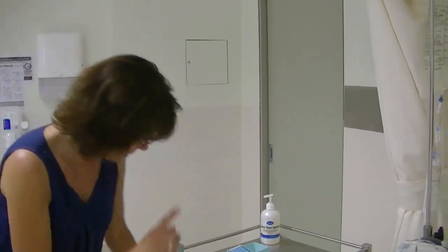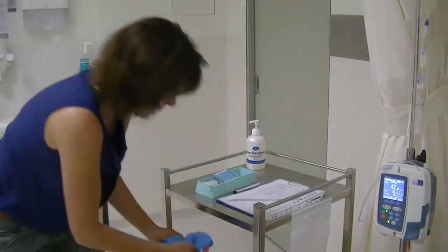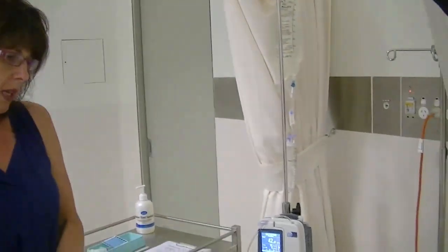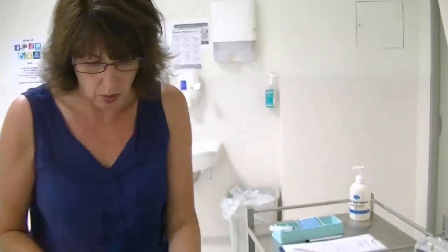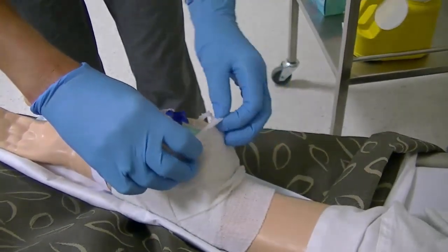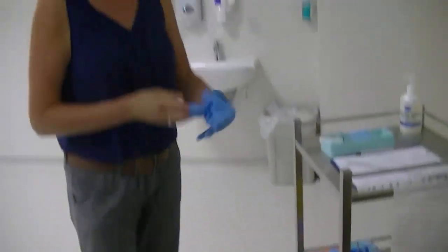Now, I'm just going to stop for a minute there and check your IV cannula, Jessica, whilst I'm just in between things. I just want to make sure this looks okay before I put the drug into the burette. Have you got any pain? No. There's no redness, no swelling, no exudate, and it seems to be running fine. Thank you for that.